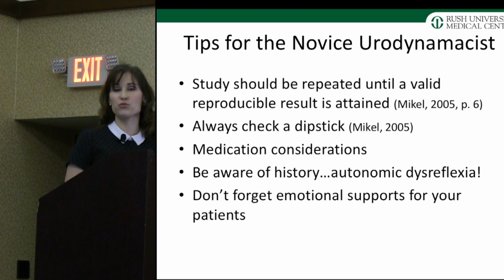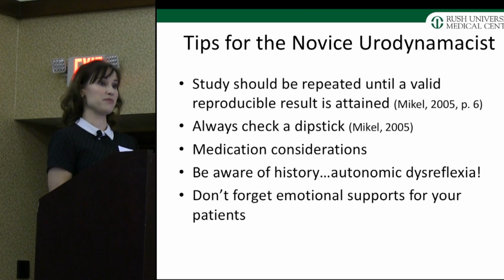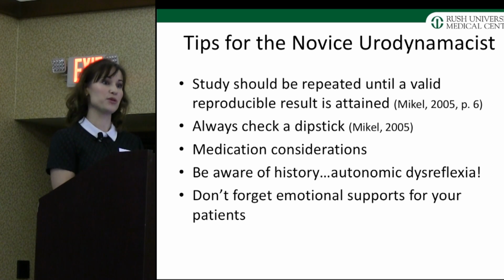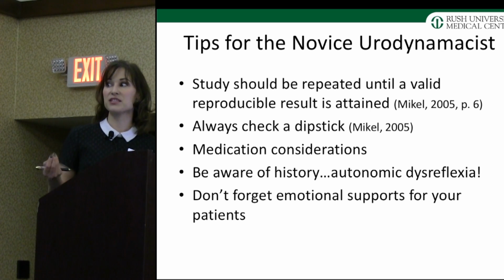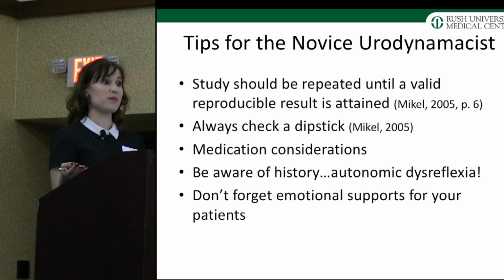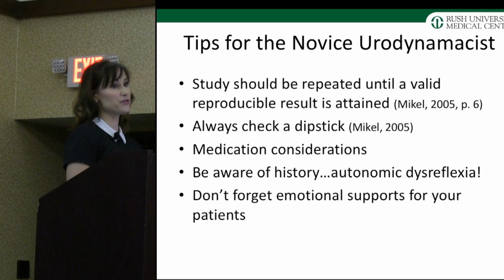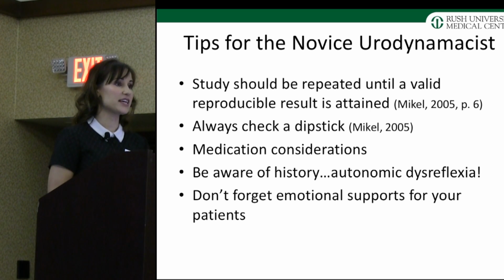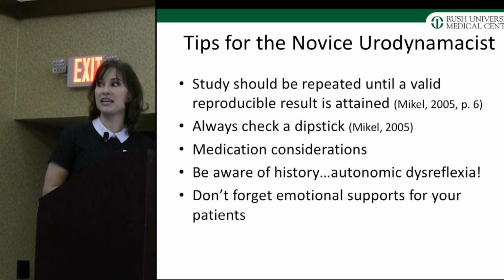Also, sometimes we're doing the urodynamic study to see if a medication is working correctly. So you want them to be on their Vesicare, their Myrbetriq, or their oxybutynin, whatever it is. And sometimes they want to see what the bladder's doing all by itself, so we'll take them off of those medications a couple days ahead of time. So make sure you know what the expectations are on that day of the urodynamic study.